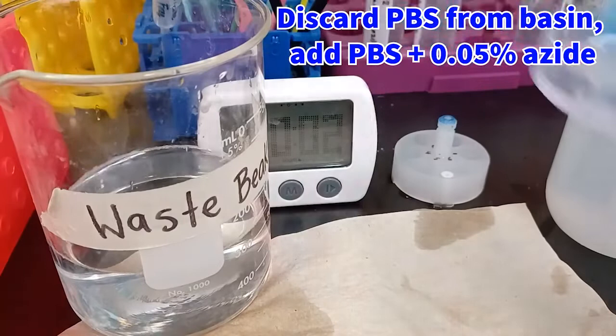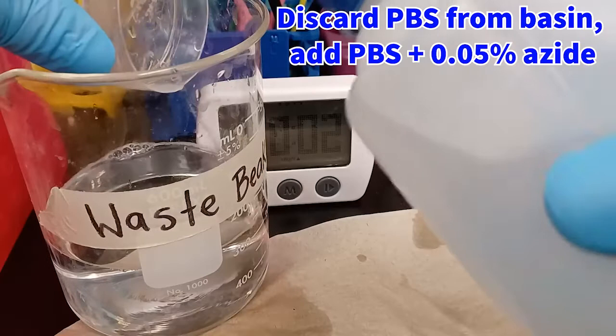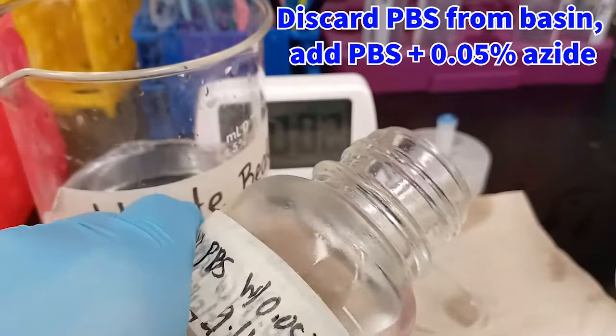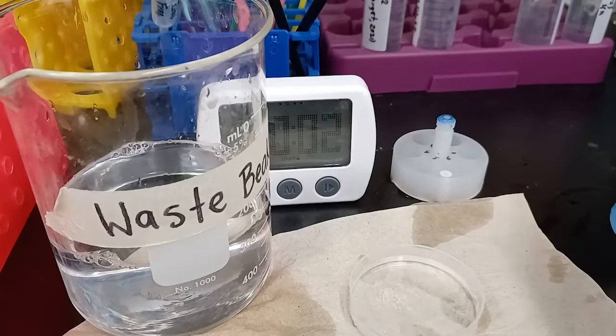Now that we have our sections in the netted insert, we can replace the solution in the associated basin with PBS plus 0.05% sodium azide, as you see here. This PBS plus azide step is one of two important steps that deactivate endogenous peroxidases in the tissue.